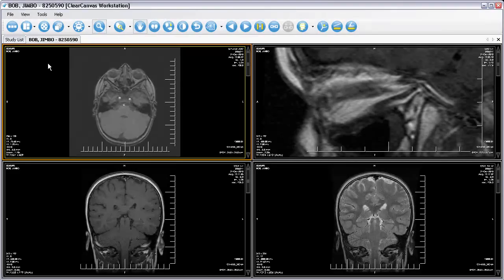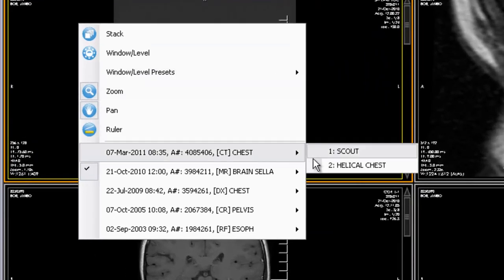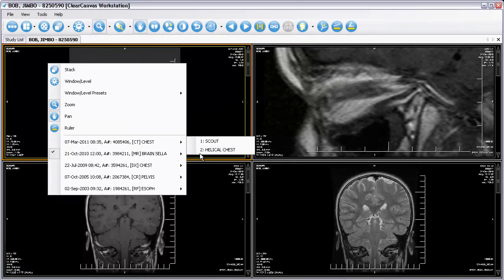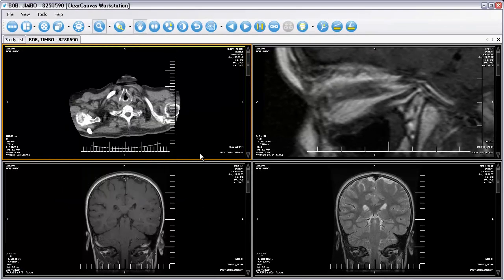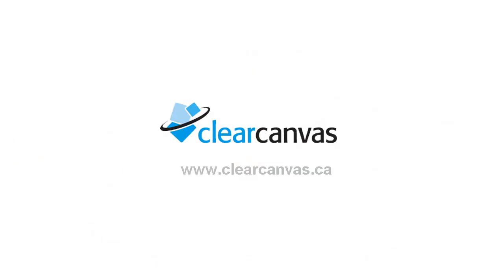If the patient you're looking at has multiple studies, you can view the images from those other studies by right clicking, then selecting the series you want to see. That's how easy it is to view your images using ClearCanvas Workstation Portable Edition.